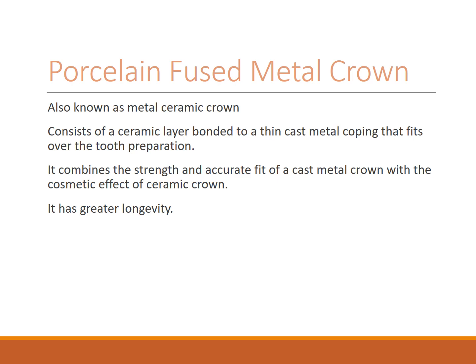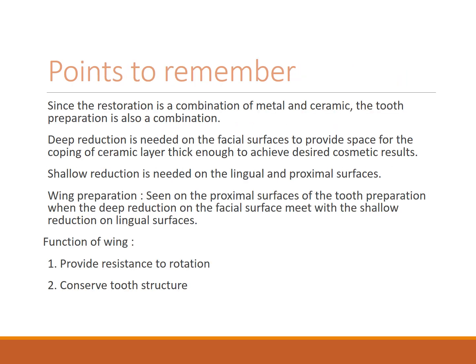Coming to the points to remember: since the restoration is a combination of metal and ceramic, the preparation should also be a combination. Deep reduction is needed on the facial surfaces to provide a thick layer of ceramic, and this can also achieve a proper cosmetic result.